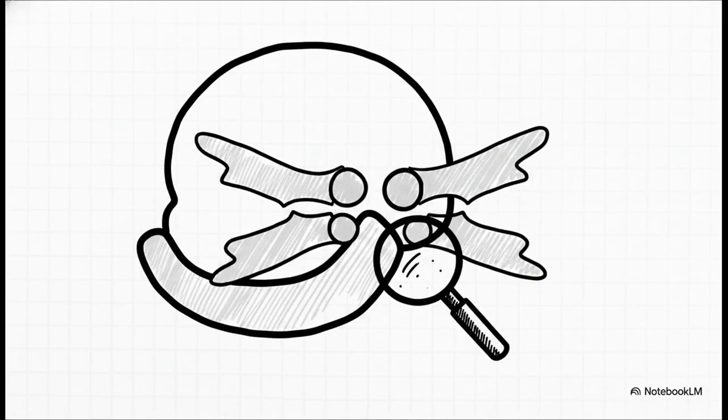So the crucial point is right here. How do you clinically prove on the radiograph that the patient actually achieved full neck extension and that the IOML was truly parallel to the IR? Well, the image holds the proof. First, you must see the mental protuberance, that's the chin, superimposed perfectly over the anterior frontal bone. Second, you must see the mandibular condyles projected anterior to the petrosi. If you're looking at the image and the mental protuberance is sitting way too far posterior, or the condyles are superimposing the petrosi, well, your patient's neck just wasn't extended enough, and that IOML wasn't parallel.